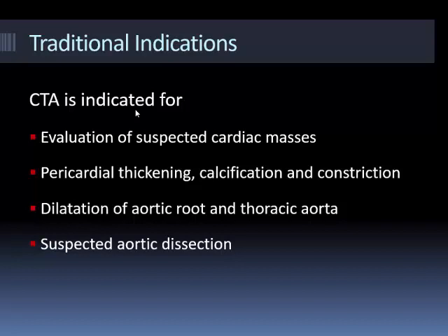CT, and I would always recommend doing a CT in cases of pericardial disease. So often you'll do an MR, you'll do a CT, and you'll do an echo, and you'll end up doing a cath as well. But CT will really give you a good 3D visualization of the pericardium and also clearly identify calcification, which is of great help.